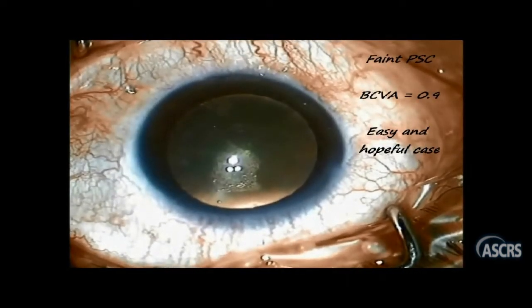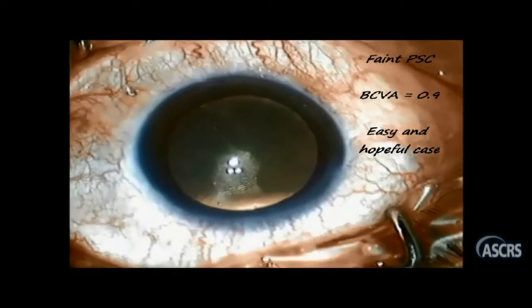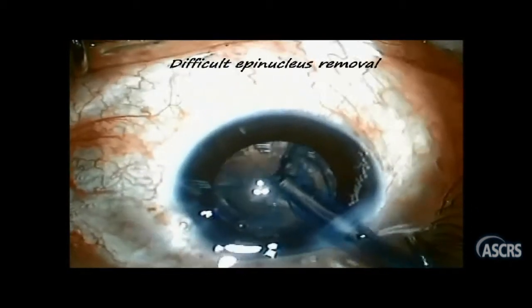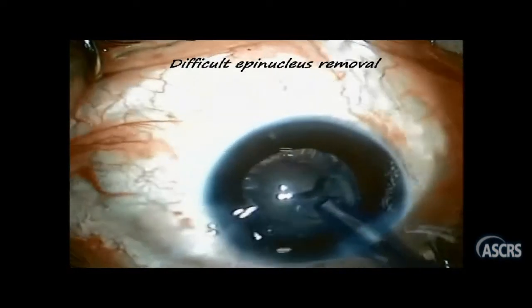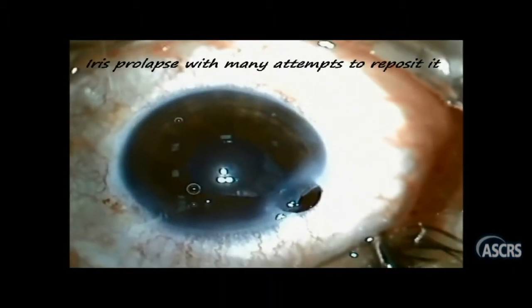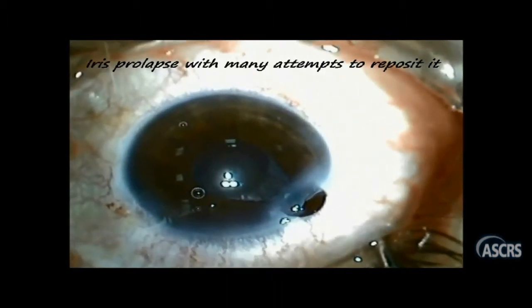I was not in the operating room as I was assisting in another case, and everything was going somehow fine except for the prolonged difficult epinucleus removal together with a prolapsed iris that should have been managed properly. But the surgeon stated that she suffered a lot doing multiple maneuvers trying to reposition the iris, but unfortunately all were failing.